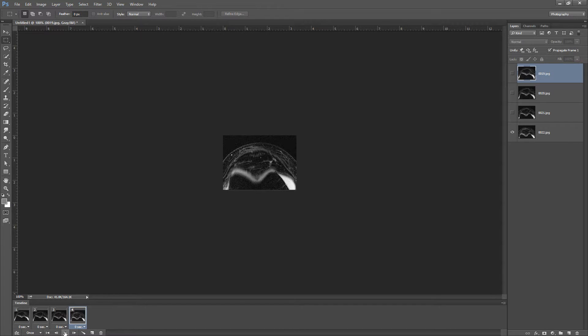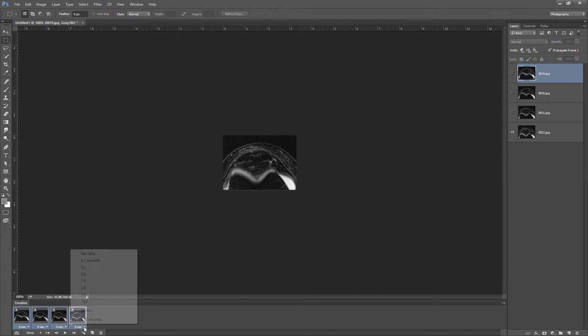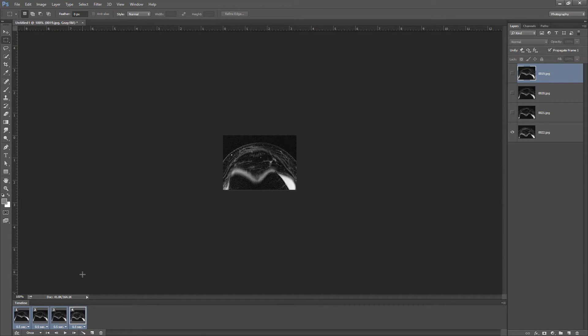If we play this, you can see it plays really fast because they're set to 0 seconds. So I'm going to select all of my frames and I want those to go for half a second per frame. And you can adjust those individually if you want to maybe hold longer on one frame to show something.